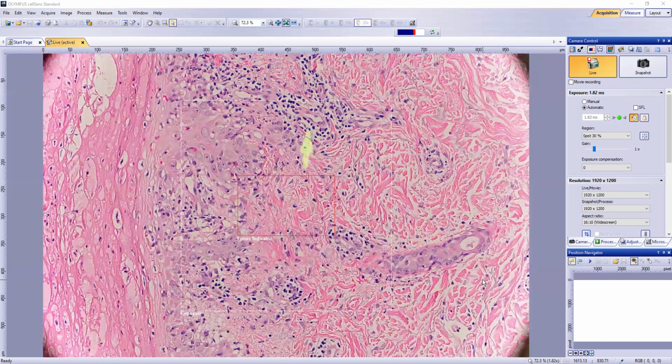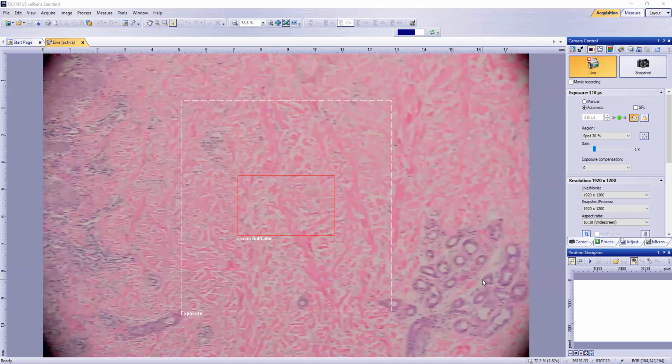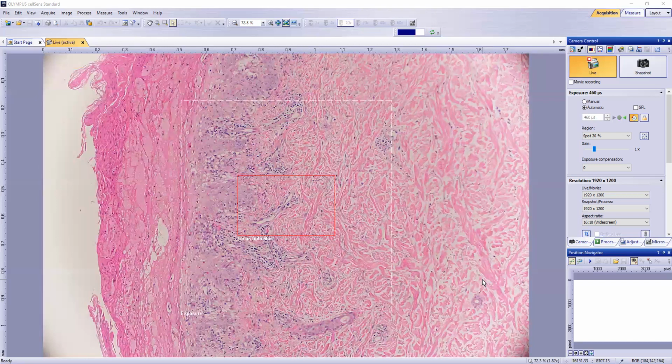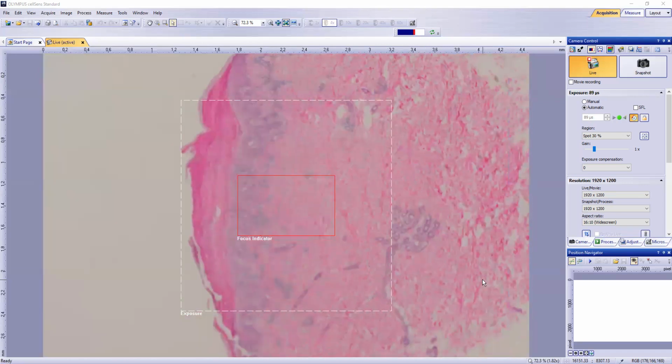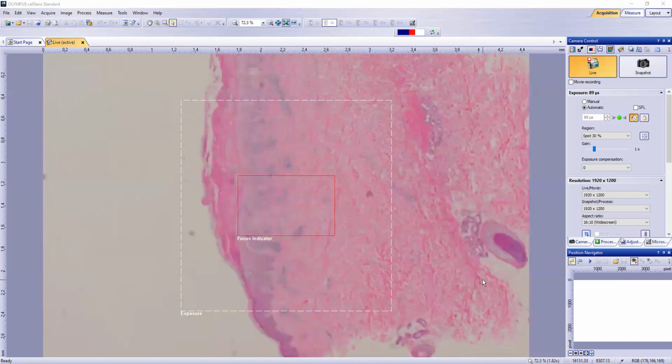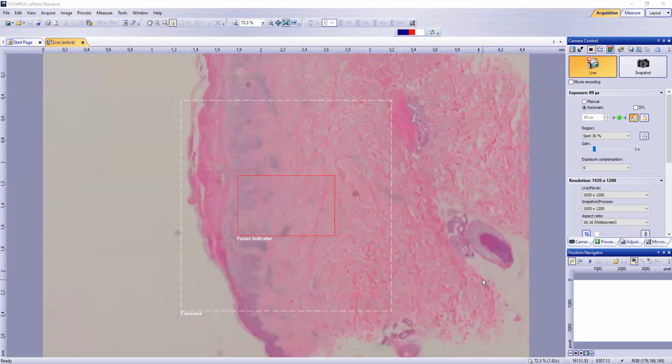You'll have a patchy perivascular lymphocytic inflammatory infiltrate with lots of extravasated red blood cells, much more than you'll ever see in Erythema multiforme. And at times you'll see those red blood cells tracking up into the epidermis as well. The infiltrate tends to be situated around the blood vessels in the superficial dermis, and then you'll also see it around the deeper vascular plexus. And so people describe a wedge-shaped superficial and deep dermal perivascular infiltrate, because it kind of tapers at the tip. So you can imagine a wedge-shaped pattern of inflammation around the superficial and deep vascular plexus.